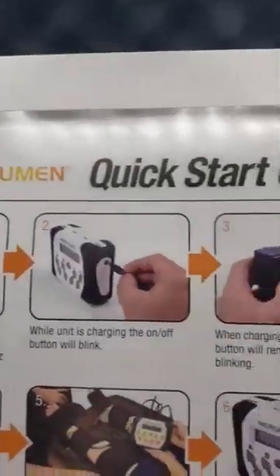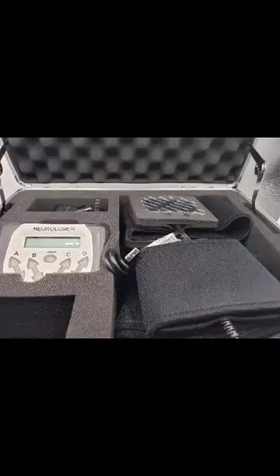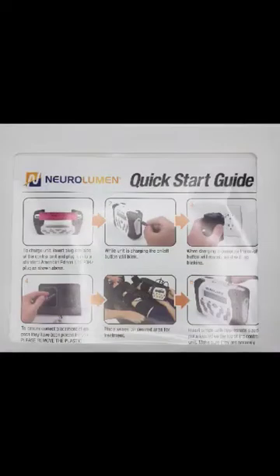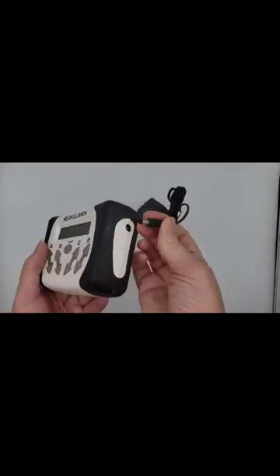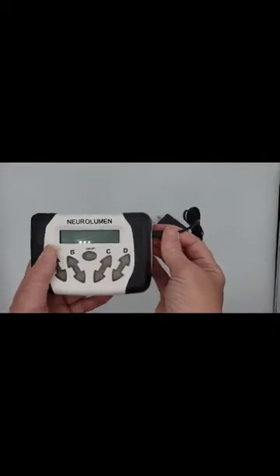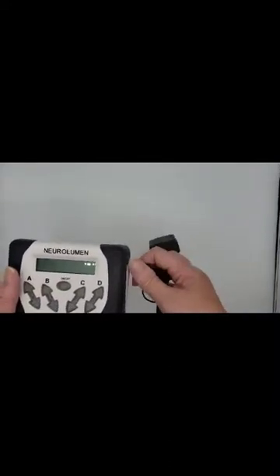Before going further though, please be sure to read the quick start guide and review the other reading materials that are inside. It is very important that you charge your unit fully before using it. That way you have the best results. You will remove the unit and the charger from your case, plug in the charger on the side port, and then plug it into a wall outlet.